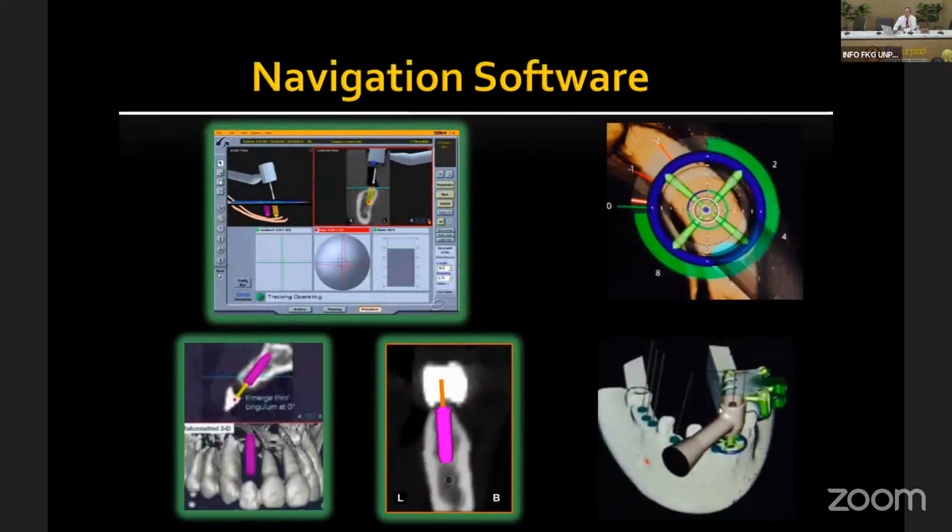Some studies also used navigation. They're testing the navigation system, like GPS for driving. A company came to our school to test it, but some people say it's still a little bit too risky. The recommendation is that if you use the navigation software, the best way to do it is to use a robot, because your hand may be shaking. The robot is kind of stable. You tell them 1 millimeter, 2 millimeters, and they can do it more accurately.